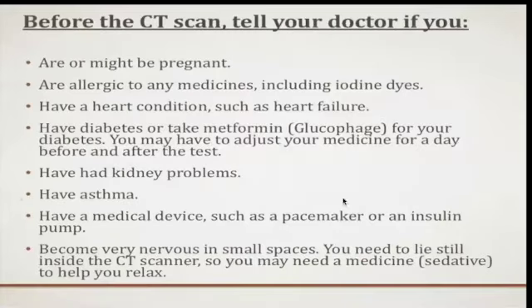So these guidelines are usually given to patients before going to a CT, and these are general guidelines which I will just read loudly over the next few slides. Most concerns will revolve around allergies or ability to excrete contrast along with any psychological burden, especially if the patient is claustrophobic.